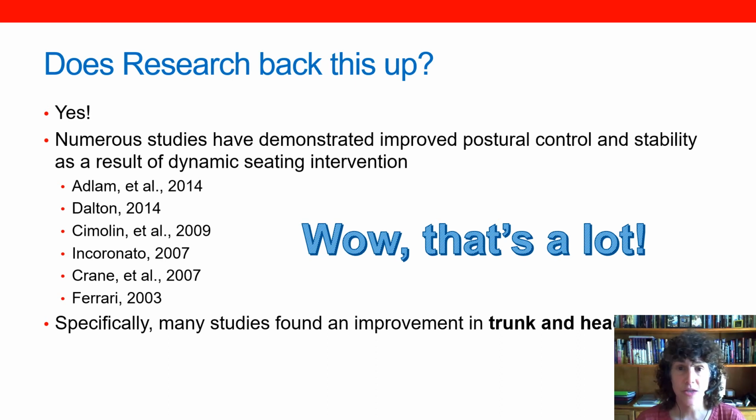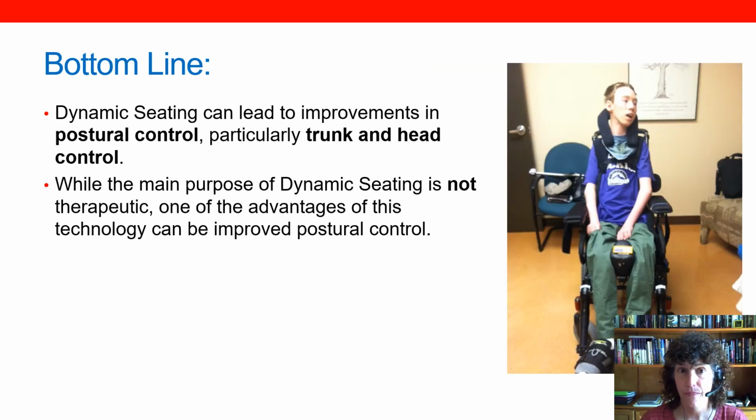But this is what we have, and there is a lot of it that does demonstrate specifically that use of dynamic seating results in an improvement in postural control. And I have seen this in my own clients. Many of the clinicians and suppliers that I have spoken to who work in this area of dynamic seating have had a similar experience. So again, specifically, many studies have found improvement in trunk and head control.